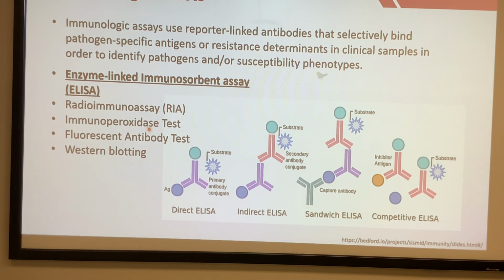And a lot of these are actually automated systems, so even the lab techs or laboratory scientists won't really go into the details to figure out what is being done. You just load the sample and the machine does everything for you. So not even you guys need to know, okay? But anyway, this is basically the immunological tests in the laboratory.